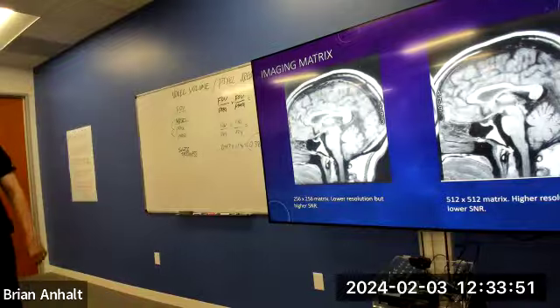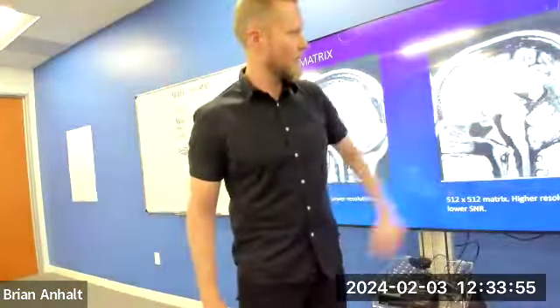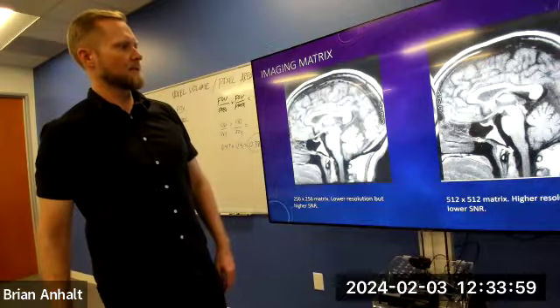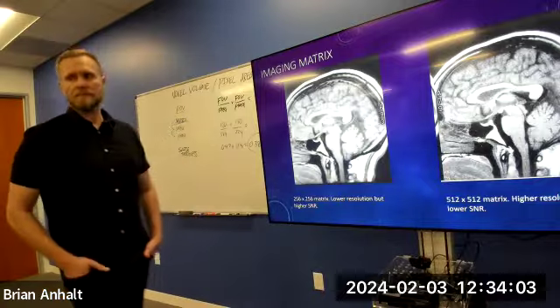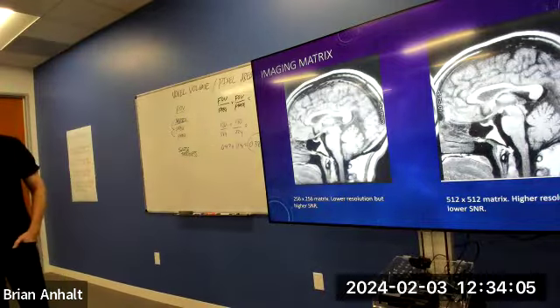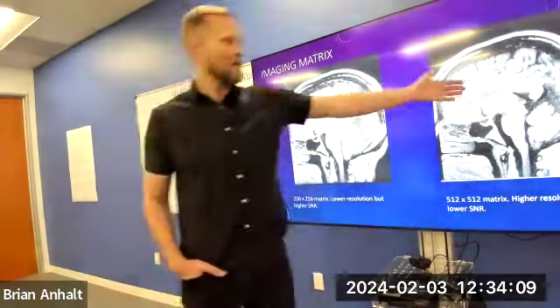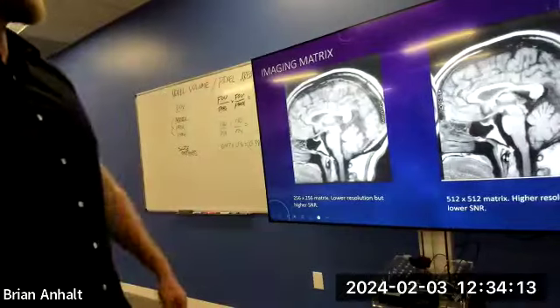That's the trade-off right there. This one definitely brighter, not as much grain. That one more detail, but definitely less SNR. So that is the trade-off in action. Honestly, this one looks fine. I would prefer this one. I'm not the radiologist, but I think the radiologist would agree.